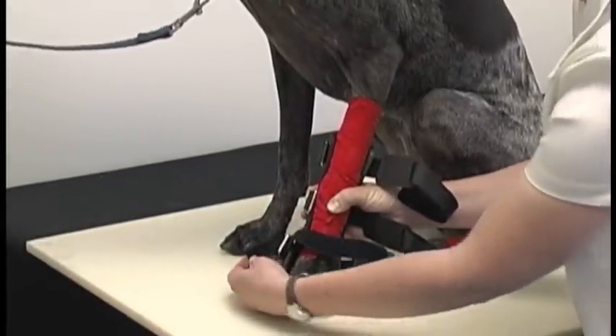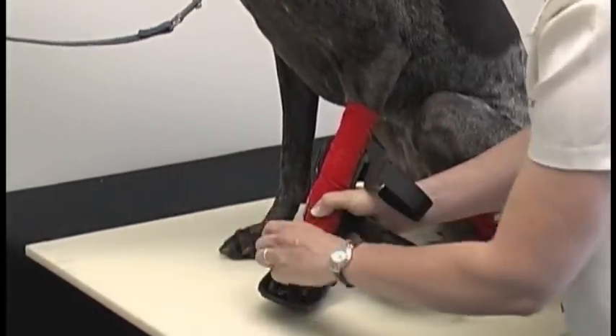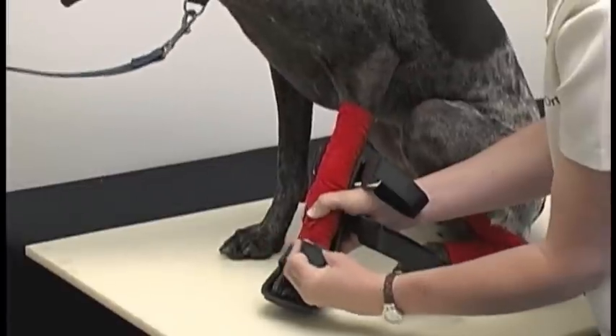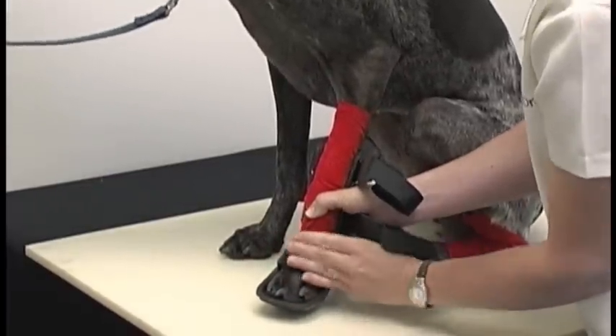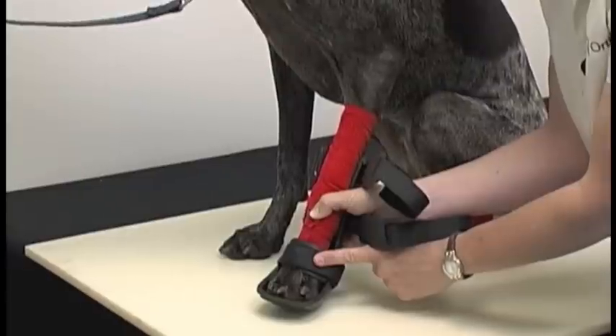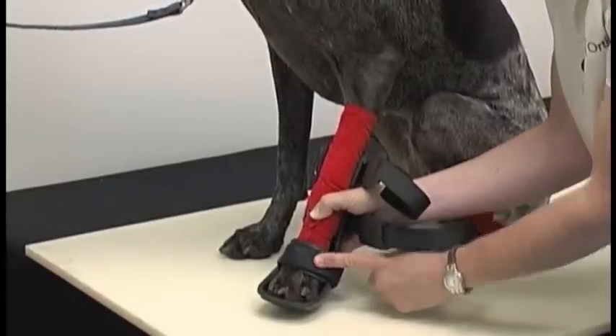Slide that through the buckle and snug the strap down. I always get the strap placed in the middle and snug that down. The bottom strap first is very important — that way it secures the fit of the splint.